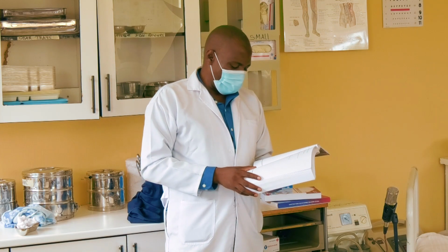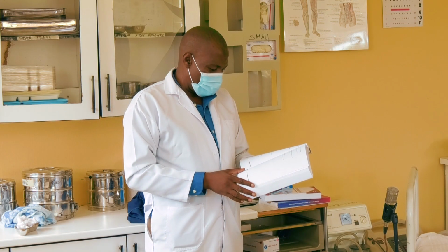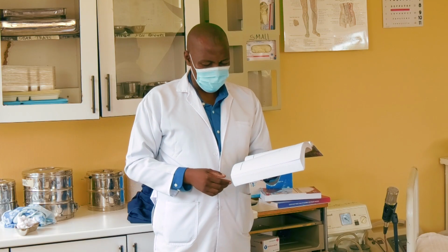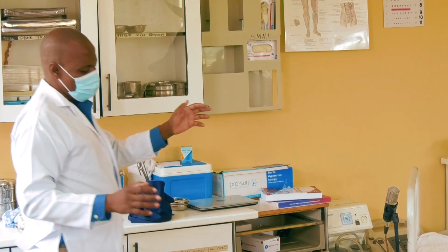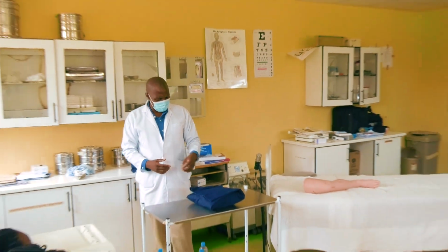Okay, shock due to allergies and scar formation. Planning: prepare the trolley, equipment and everything else. So we'll talk about this as we go on. The one who was going through this will be helping us just to ensure that we have everything. Now you come to your pack, get your pack wherever you keep them.